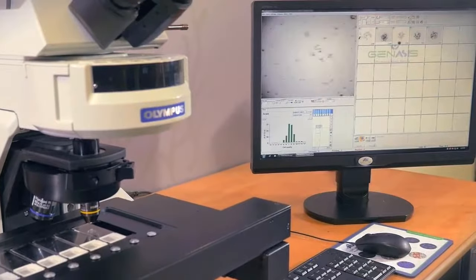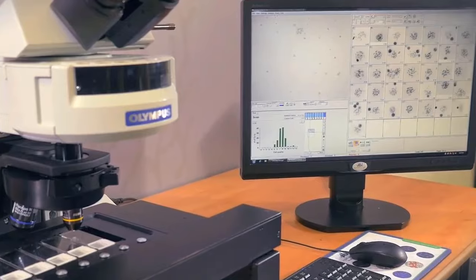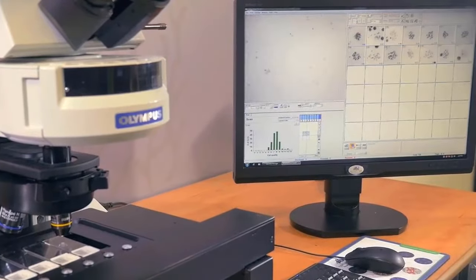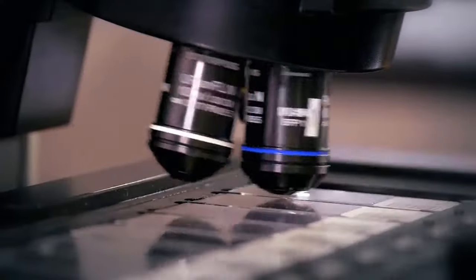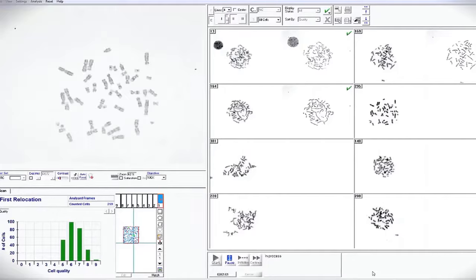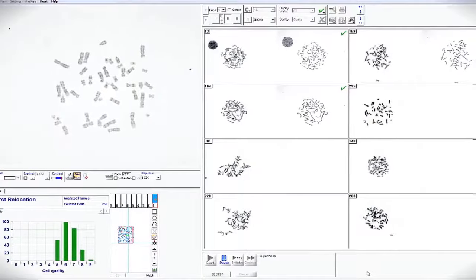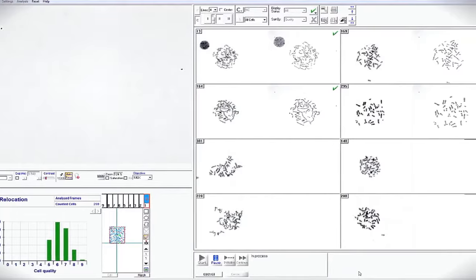a relevant slide region, ensuring optimal success rate, even for the most challenging and low-mitotic samples. A high-magnification objective is then used to capture the relevant metaphases, either automatically or manually.